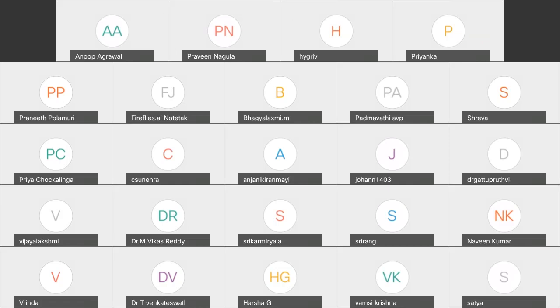Now, was the LV dilated, or what are the dimensions on MRI of the LV? Is it looking dilated based on the report? So the LV size is normal. EDD 41 millimeters, interventricular septum 14 millimeters, 1.4. I'm looking at the numbers, none of it suggests dilatation. LV mass is increased, but there is no dilatation.